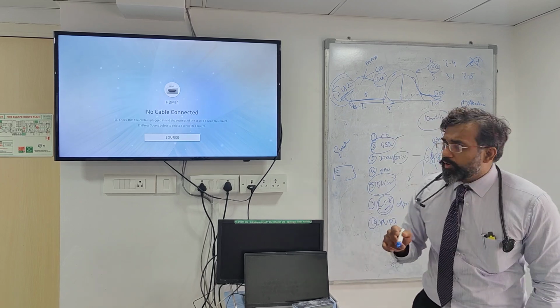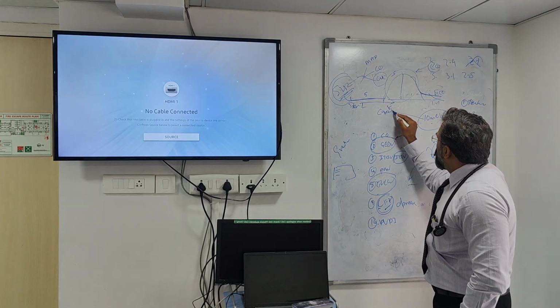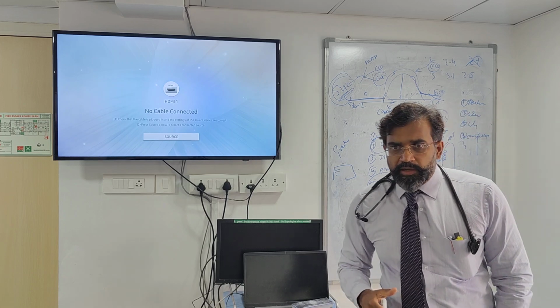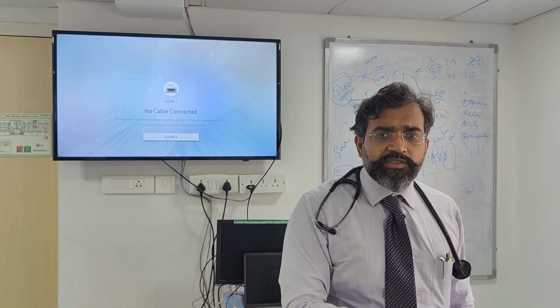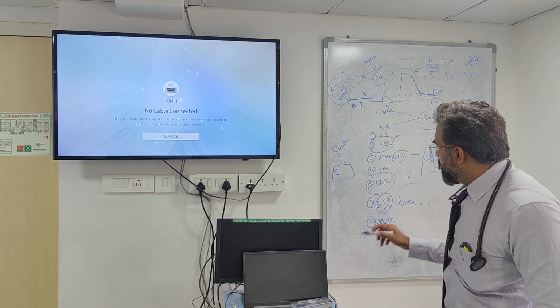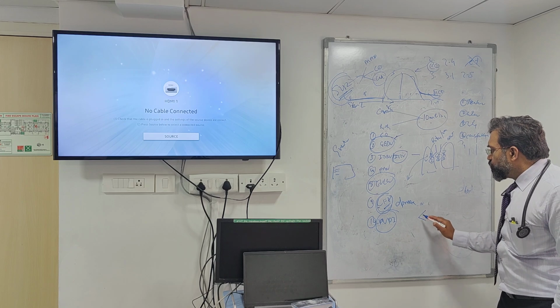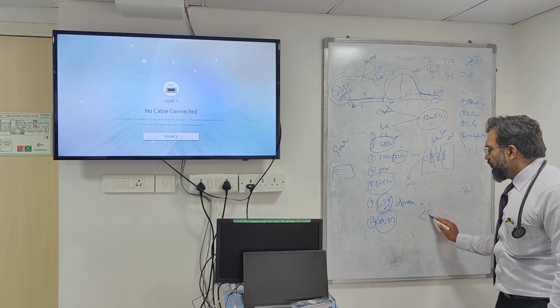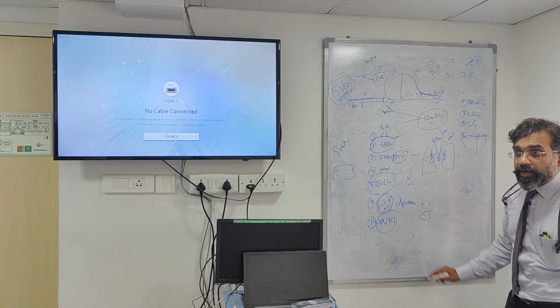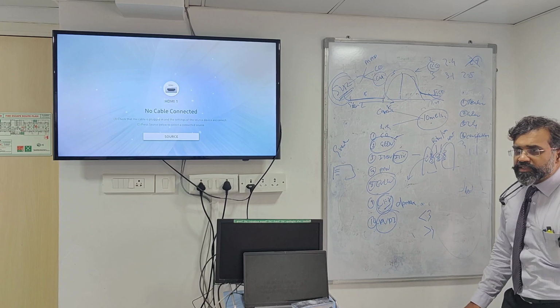Now I want to figure out whether this pulmonary edema that is occurring is because of a capillary leak, or is it because of hydrostatic pulmonary edema, like for example fluid. Is it because the cardiac system is causing hydrostatic pulmonary edema, or is it just capillary leak? For that, I look at PVPI. If the PVPI is less than 3, this means that this is hydrostatic. If the PVPI is more than 3, it means it is leaky capillaries.